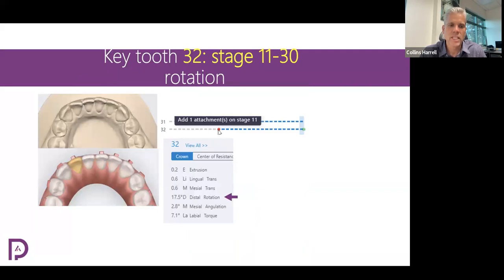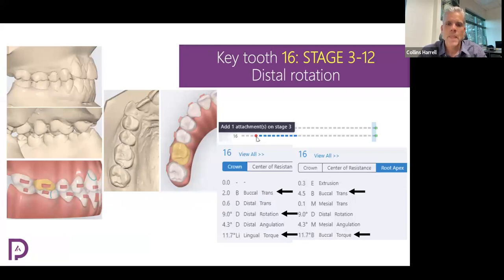Okay, looking to see that he got overcorrection. So you can see this tooth here was rotated mesially. So as we correct it, we'd want to see a little bit of distal rotation. Like I want to see just a degree or two of almost extra twist where the distal's in and the mesial's out just a little tiny bit. So to the patient, it looks perfectly straight, but to us, we know there's a slight overcorrection there. Okay, so that's key tooth movement. You can click on every tooth and see how much movement they've applied to each tooth.